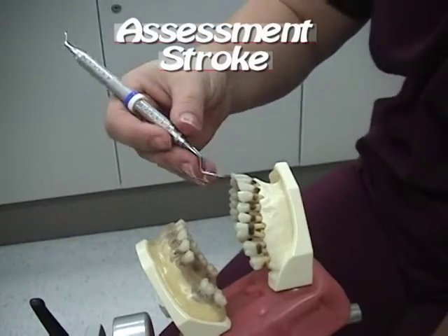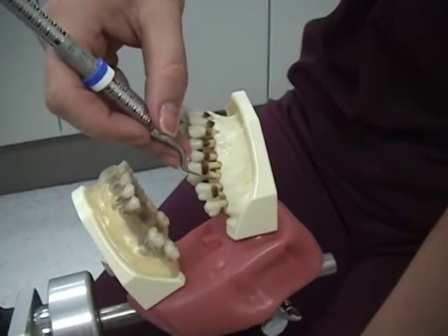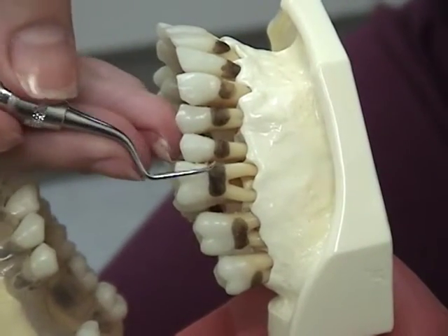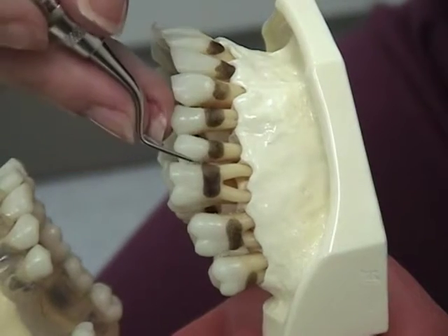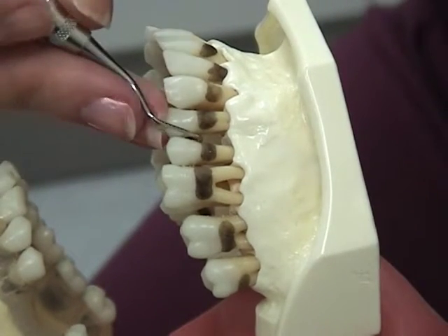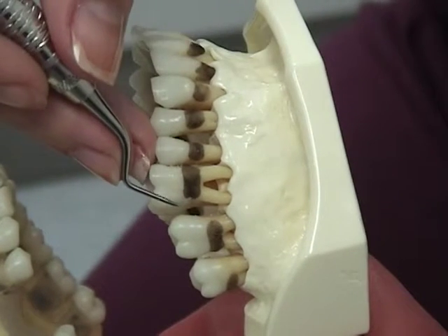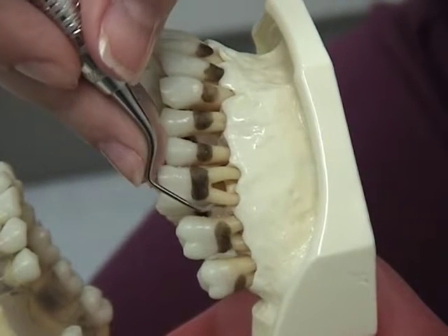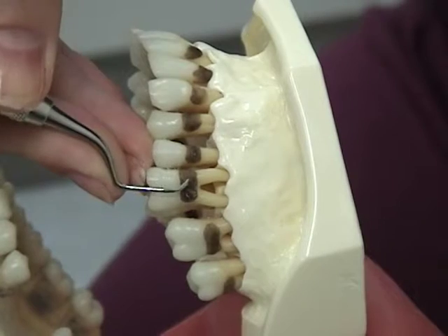Assessment stroke: as you move the instrument, your fulcrum finger supports the weight of your hand and instrument. Begin the stroke by pressing down slightly on your fulcrum finger and moving the instrument in a smooth motion up and down the tooth in a vertical or oblique direction. The stroke will be one to three millimeters in length in areas of tissue health. Working stroke: press down firmly on your fulcrum finger and move the instrument in a smooth motion — the stroke will be one to two millimeters in length.